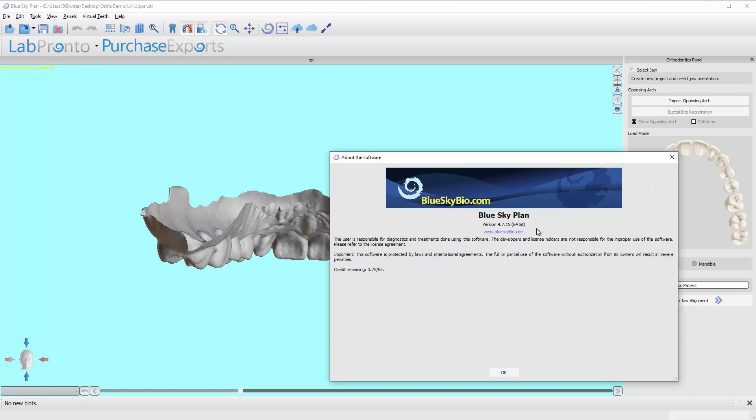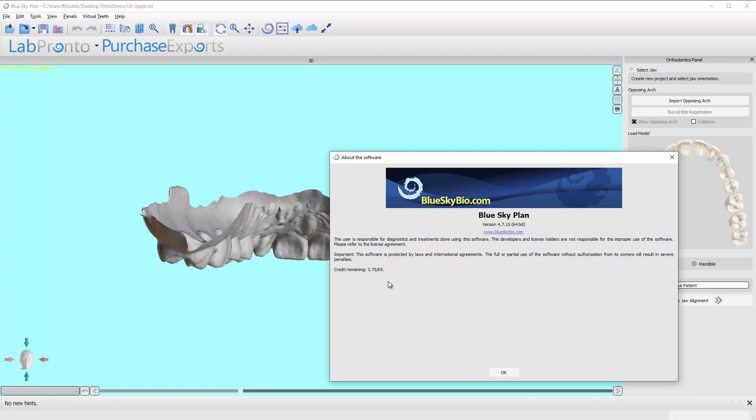be sure to know what version you're running because sometimes you might run into a problem that has been discovered, but you are running an older version of the software and that's a quick and easy fix if that is the case. So be sure to be aware of what version you're using and this will also show you how many credits you have. Usually if you've purchased, in this case 65, I have 3.75 remaining which means I'm probably need to update and add more just so I don't run out anytime soon.